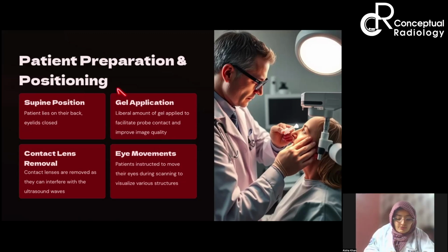Then contact lens, if the patient is wearing contact lens, you have to instruct them to remove them before, because they will interfere with the ultrasound wave transmission. Now comes eye movements. तो इसमें ये important है that patient is instructed to move their eyes during scanning. However, you have to clearly give instructions before starting your ultrasound.